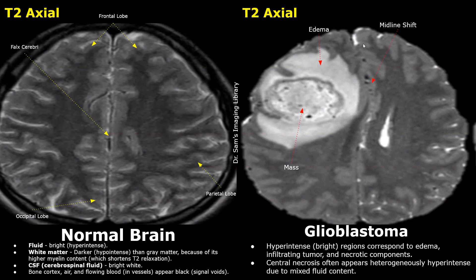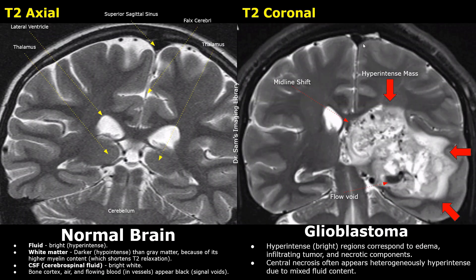Here are coronal T2 images of the brain. A large, irregularly shaped mass is present with hyper-intense and heterogeneous areas. Flow voids are also present in this case — these are the hypo-intense tubular structures.